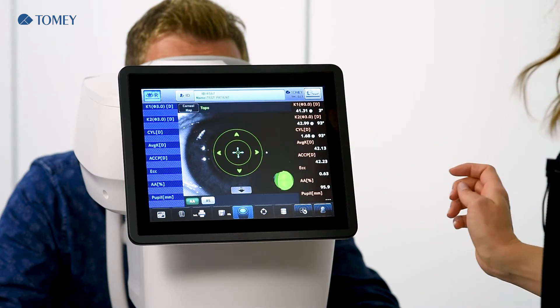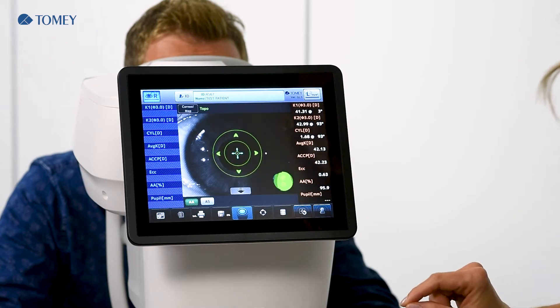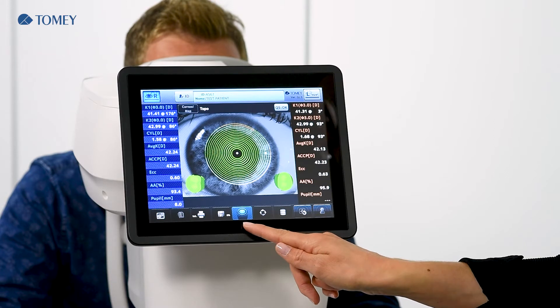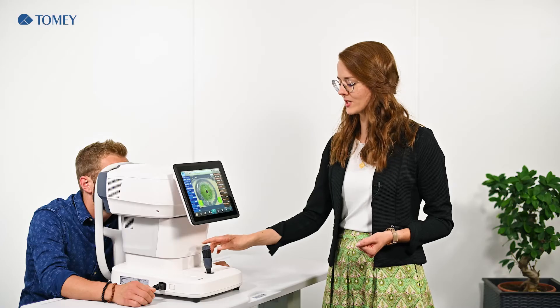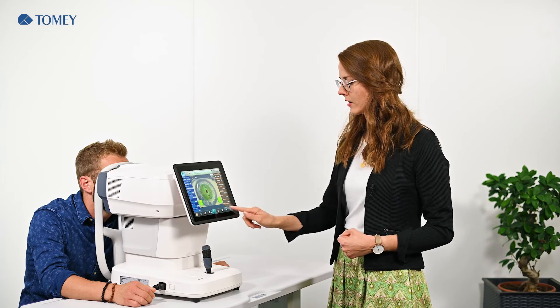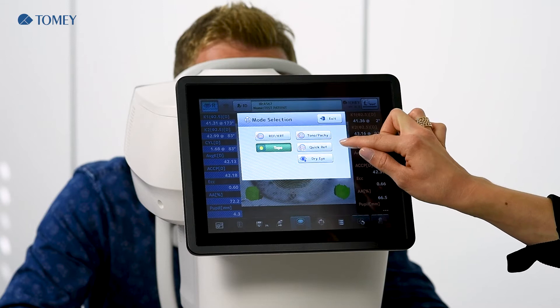Now again blink one time, please, and keep open. You can activate the measurement by touching the auto shot button or the examination button in the display, or another possibility would be using the measurement button on top of the joystick. Now the topography is finished and we change to the tono and paki mode.